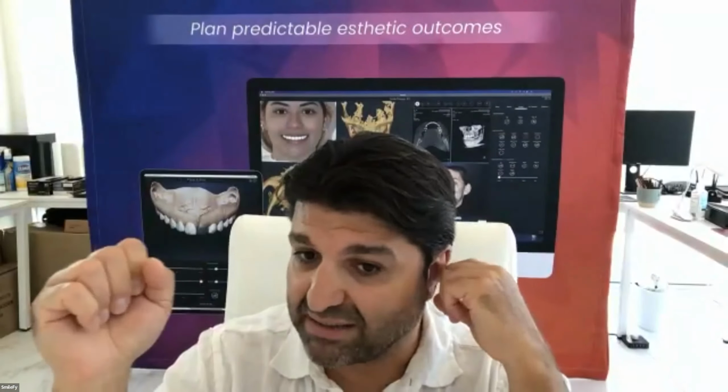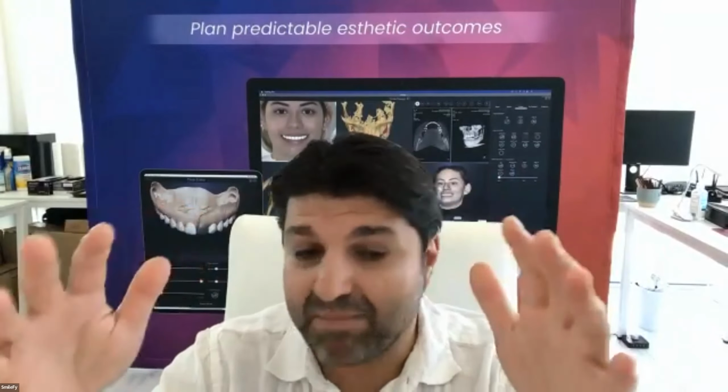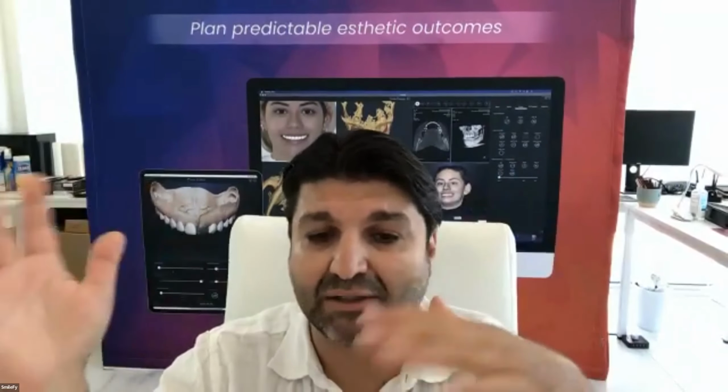So let me explain to you what is missing in the crown lengthening. You know that our software runs on Mac, iPad and iPhone. CAD features require powerful devices, but I don't want you to be trapped with an iPad that doesn't work and you cannot create the guides.